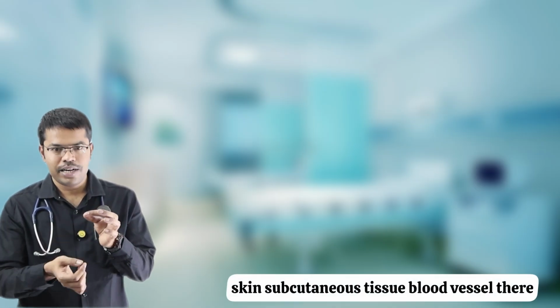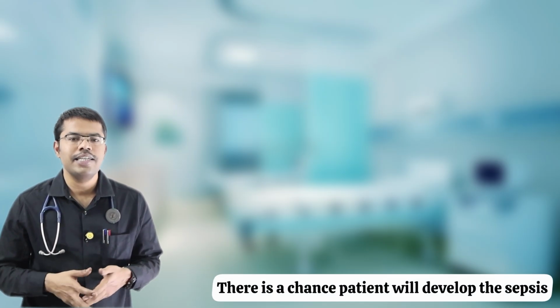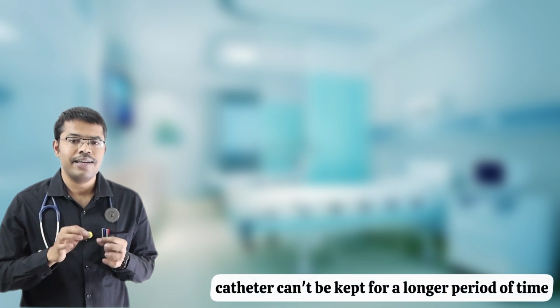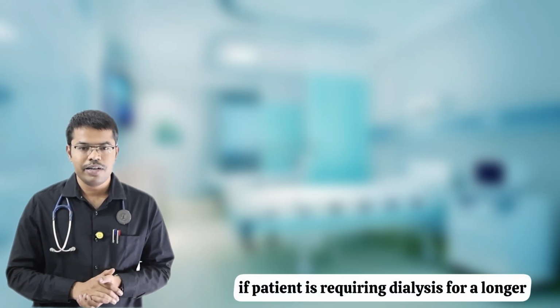Why? Through skin, subcutaneous tissue and blood vessel, there is a risk the infection can spread from the skin into the blood vessel. That is sepsis. There is a chance the patient will develop sepsis. So that is why there is a time limit. The catheter can't be kept for a longer period of time. We have to remove it. Suppose the patient requires dialysis for a longer period, what to do?